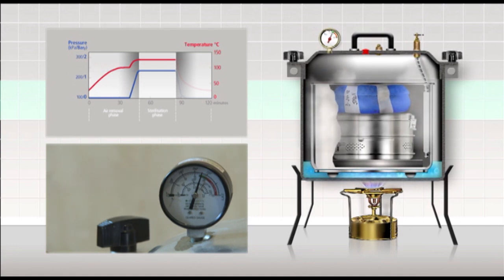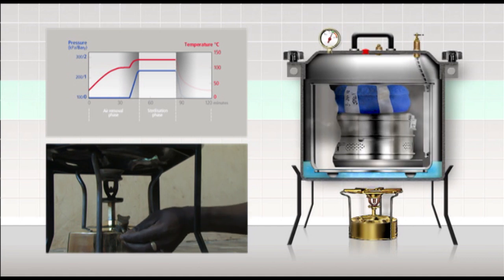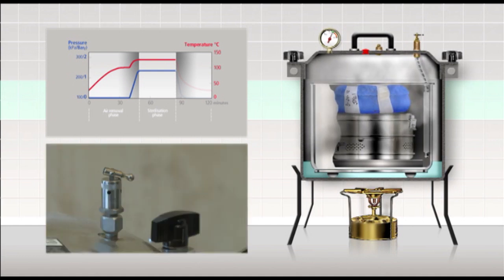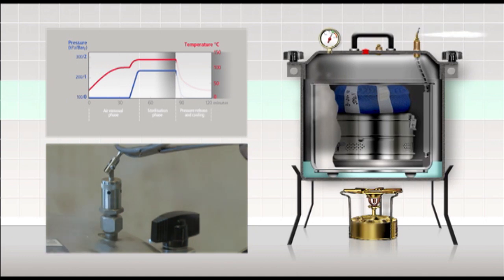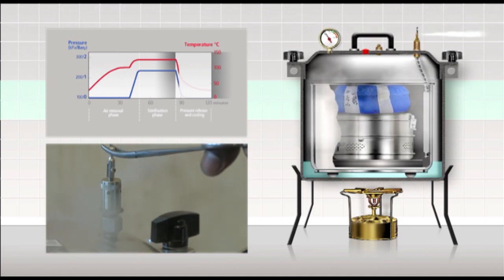At the end of the sterilisation period, turn off the heat source and move the lever on the control valve to an upright, vertical position so that steam is allowed to escape. To avoid touching the hot lever or being burnt by the escaping steam, use any object such as a pencil or forceps. When the lever is fully upward, the steam will escape at maximum.